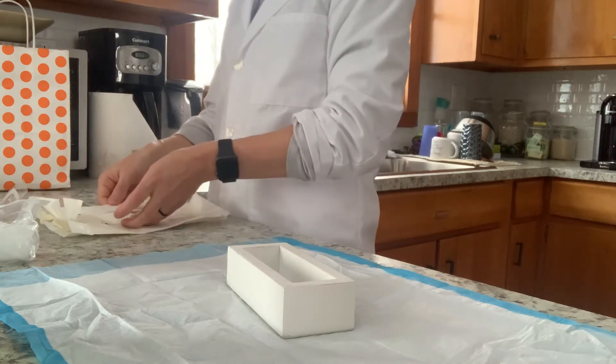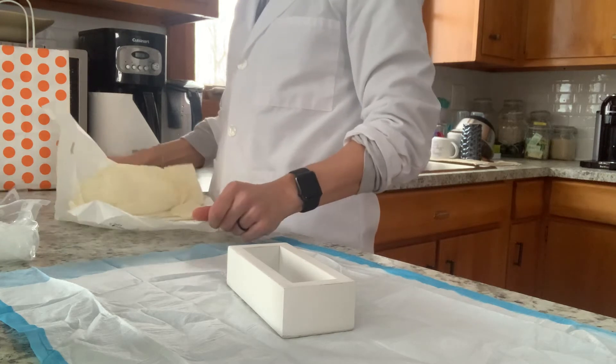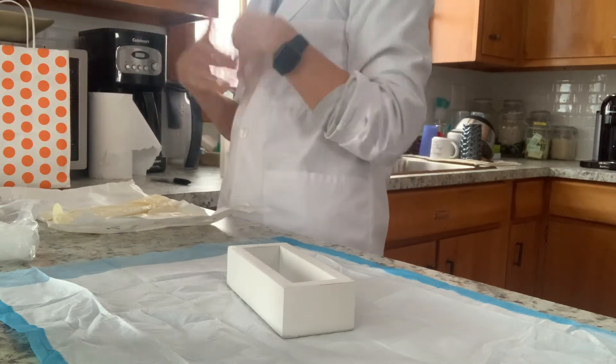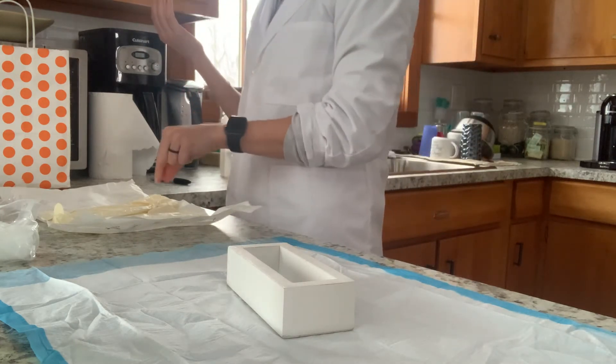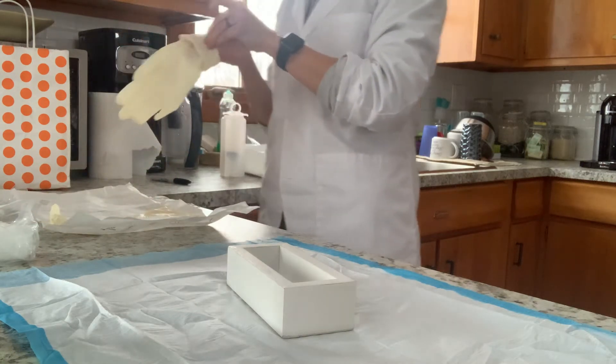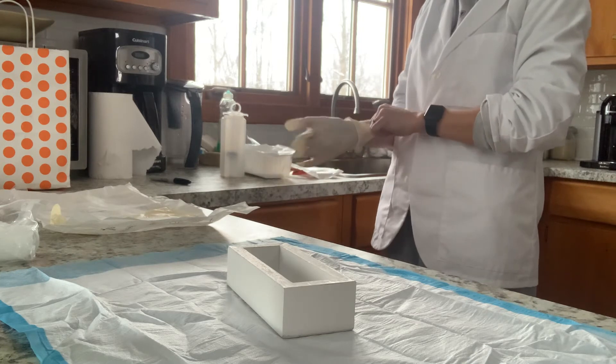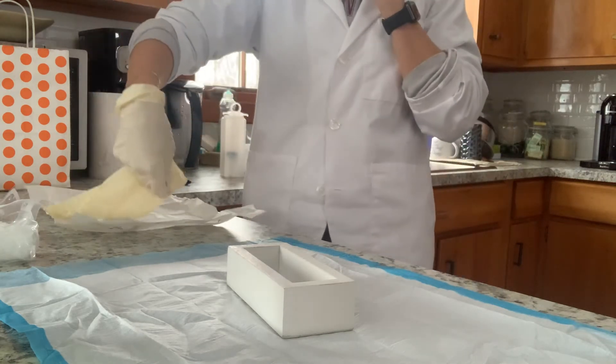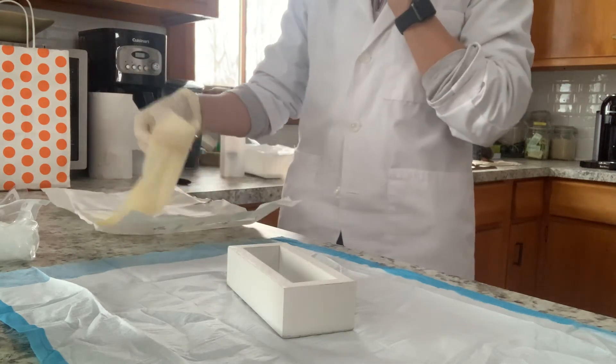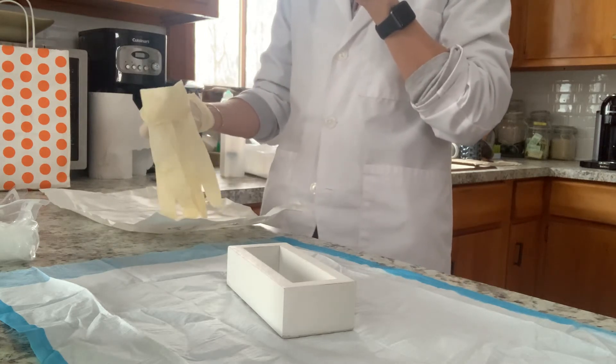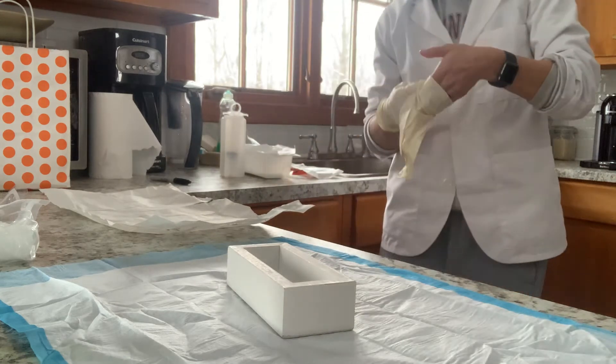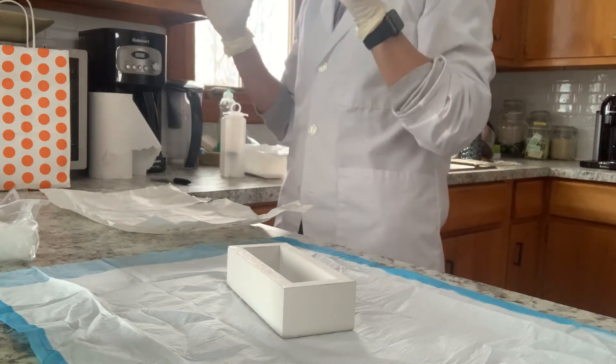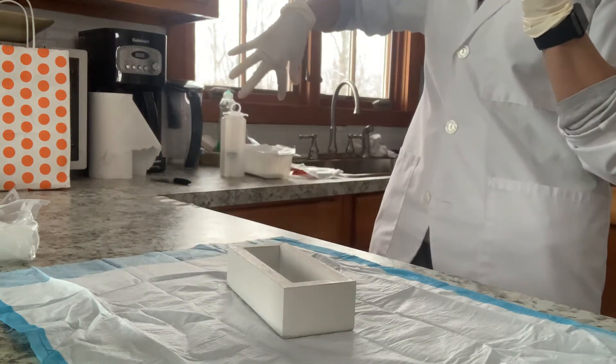And after I put my sterile gloves on, I'm going to actually, let me move all these things into position. My ABD gauze would obviously be in better standards. So hand hygiene. Now I would take my gloves out of the package. And again, we're going to pretend there's a garbage right next to me or underneath me so that I don't have to worry. So I'm going to start with gloving my right hand. So I'm touching the inside of the glove. I'm going to back away from my sterile field and then I will grab the cuff of my left glove. Now I am sterile. I will touch the inside of my package and push it away.